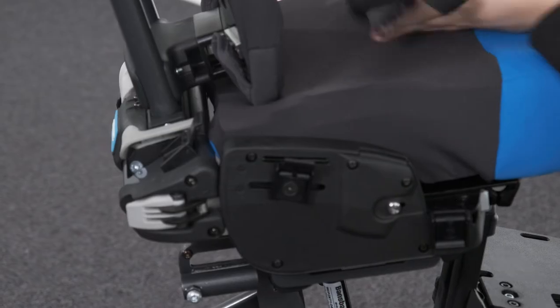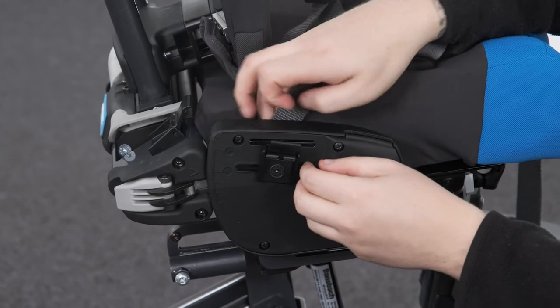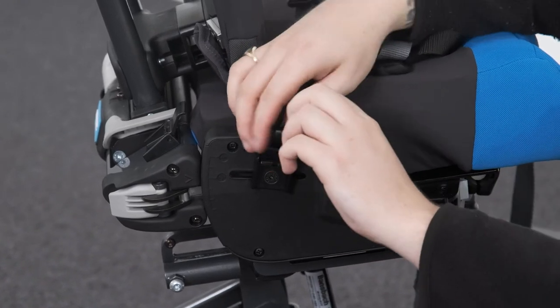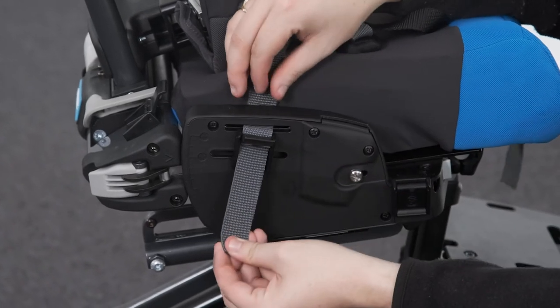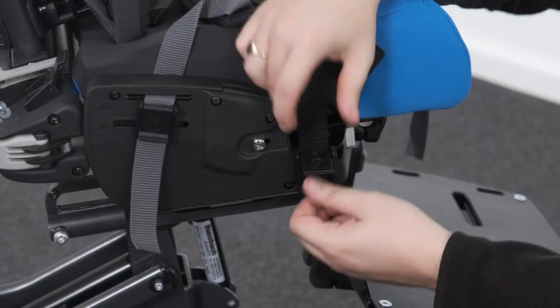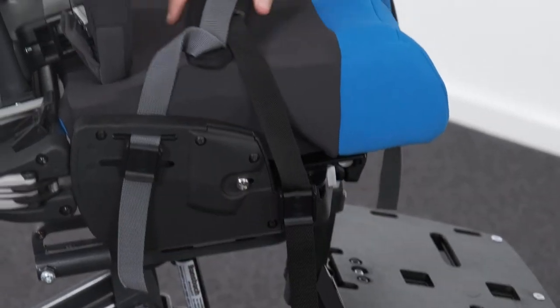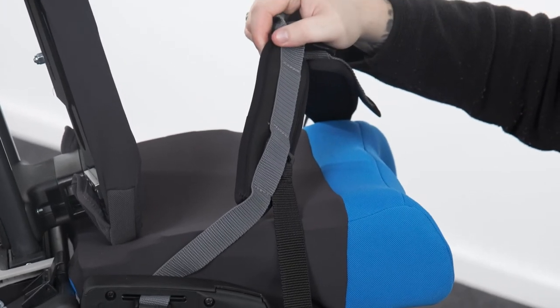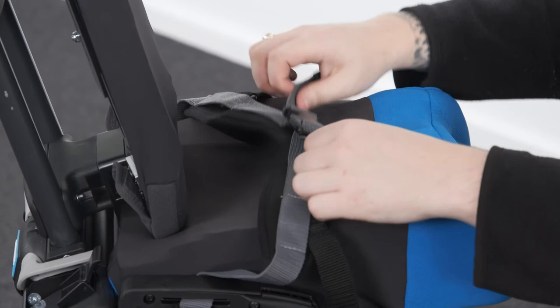Attaching the four-point belt. To attach the four-point belt, pass the grey webbing through the upper slot in the seat moulding and then through the cam buckle. Pass the black webbing through the cam buckle at the front. Pull the webbing taut and secure the cam buckles. Ensure the belt is orientated with padding facing towards the child. Attach the buckle at the front to secure the user.